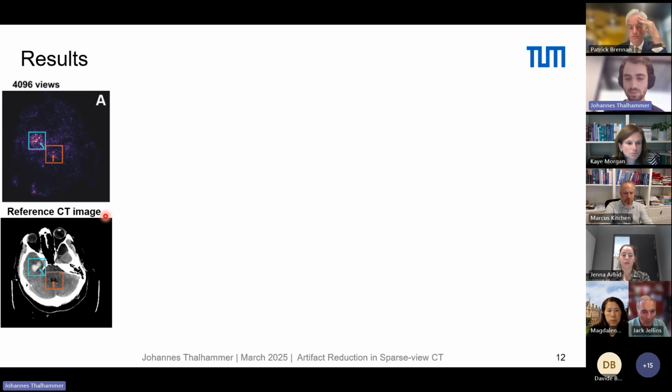So in a way, you can investigate which were, according to the network, the most important pixels for the classification result. And here for our fully sampled images, we can see here are again the two hemorrhages, and the network focused exactly on these two regions, mostly also here, but down there, but I guess that's all right. But again, mostly on this very bright hemorrhage, which is kind of what you would expect.